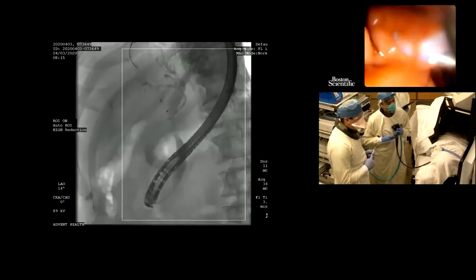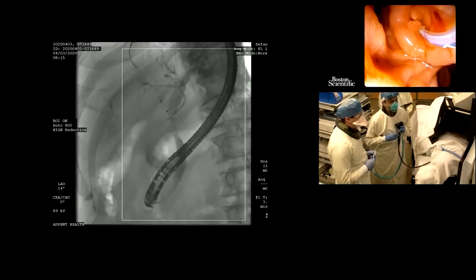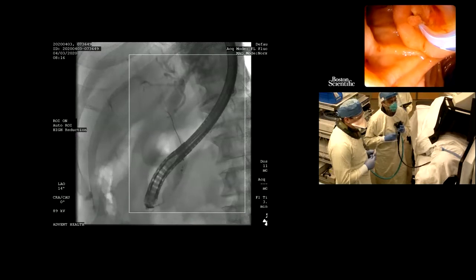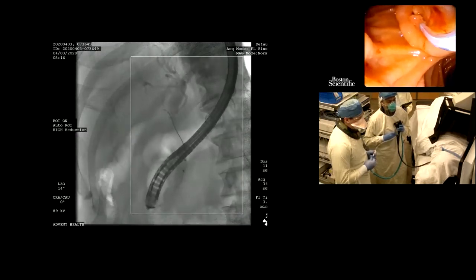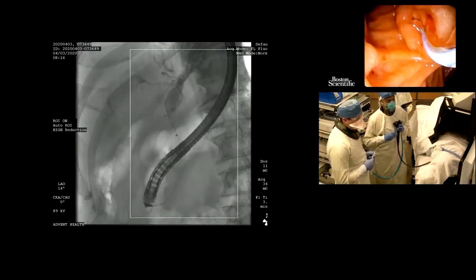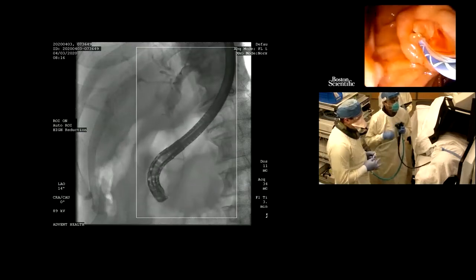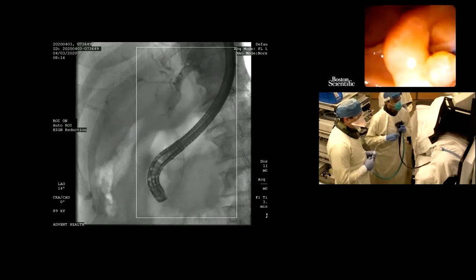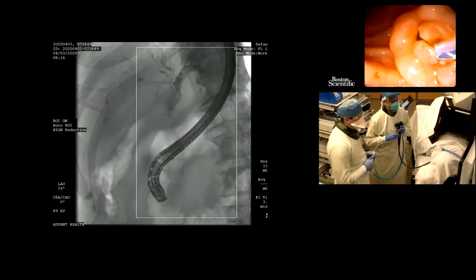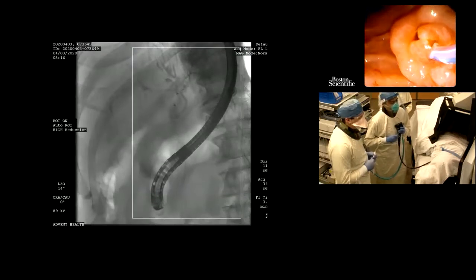Particularly in this case, fluoro, please. So what we are doing is just wash this contrast. And now we are trying to wash the contrast in the left system, fluoro, please. I'm going to let Enrique try to see if he can advance the wire. There you go, fantastic. And we're going to irrigate the system as well so that we can remove all the contrast from the patient. Fluoro shot. Beautiful. We're going to still a little bit of irrigation, and I think we're good to go.